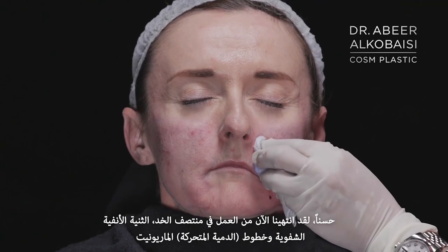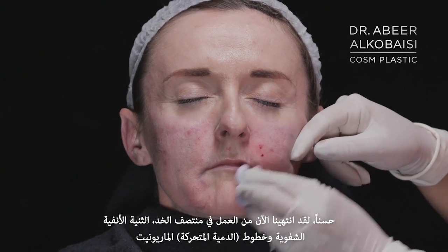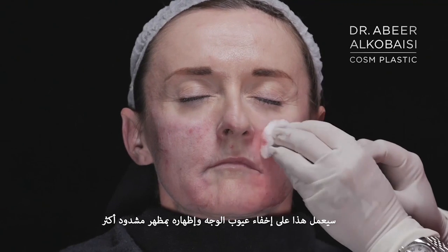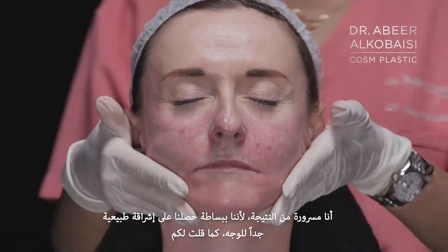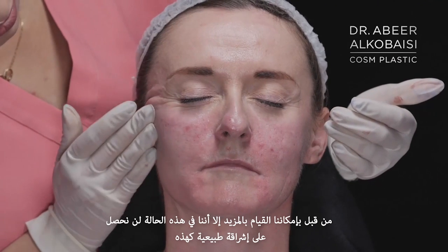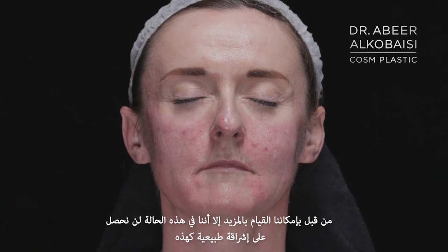Okay, so we're done with the mid of the mid-cheek, nasolabial fold, and marionette lines. This would actually give a camouflage as if the face has been lifted up. I like the results simply because it gives you a very natural effect. As I said, we still can do more, but more means not natural.